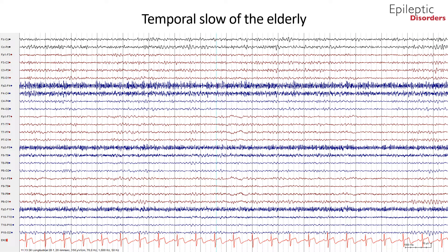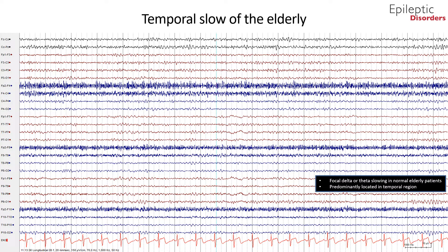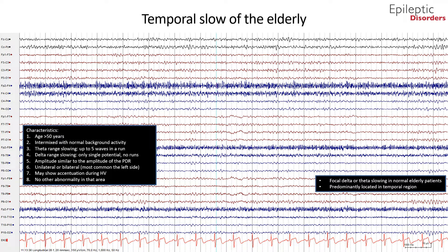In this bipolar montage EEG, we will talk about temporal slow activity of the elderly. This is a pattern of uncertain significance but usually not considered abnormal. It is defined as unilateral — most often on the left side — or bilateral short runs of theta or delta activity intermixed with background activity over the temporal regions in subjects greater than 50 years of age without clinical abnormalities. It often accentuates during drowsiness and hyperventilation. The concept is an attempt to reduce false positive findings on EEGs of elderly patients.